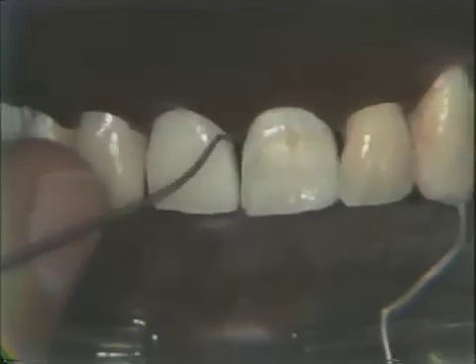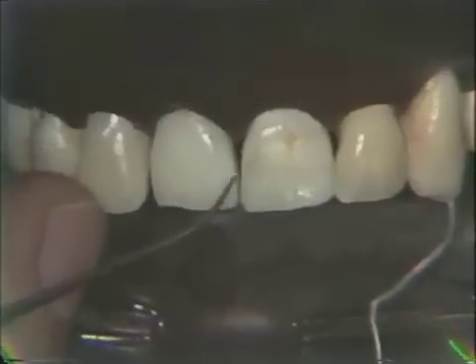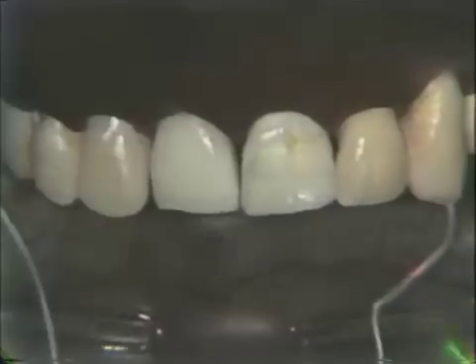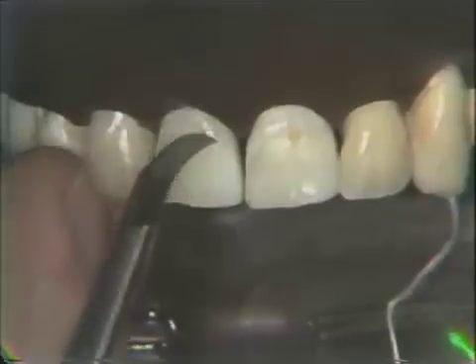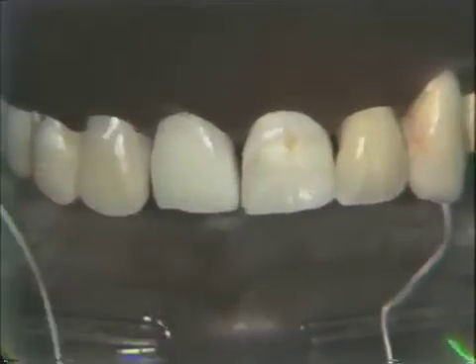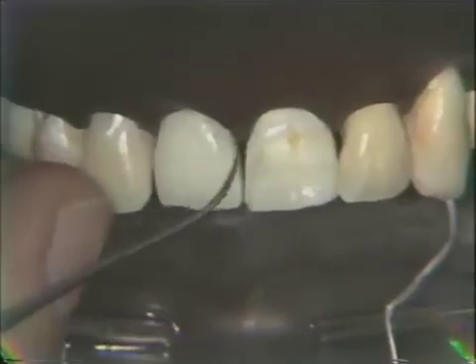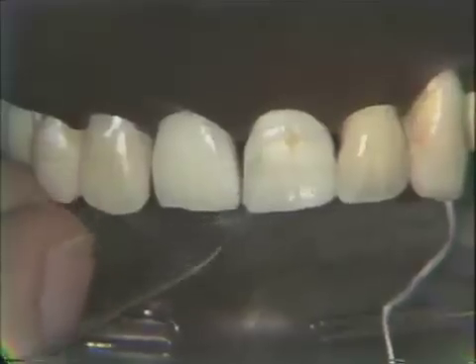If you look at it from the labial, you will see there is a slight bit of excess at the cervical and even down to the incisal a little. So with our 12 blade, we will now trim that labial area, cutting with the blade touching the tooth and the restorative material. Now checking again.